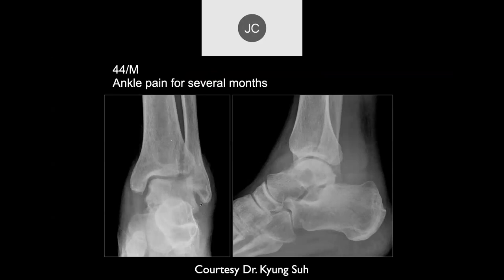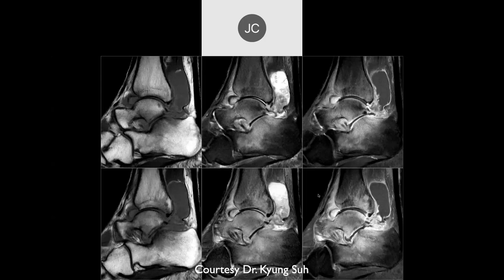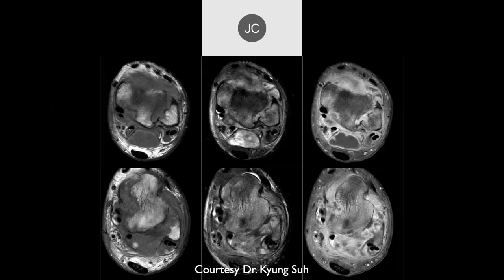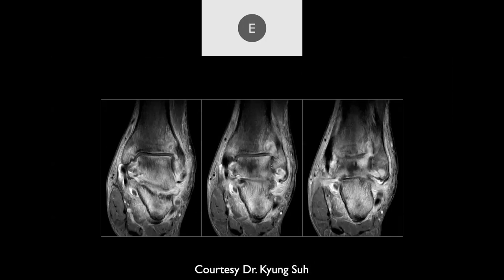A 44-year-old with ankle pain for several months. The subtalar joint region looks a bit sclerotic with the talus and calcaneus, and there's not much fat posteriorly. On MRI with contrast, there's a fluid collection extending posteriorly from the joint space, bone edema, and peripheral enhancement suggesting a big abscess. On PD fat-suppressed images, there's bone edema, probable subchondral disease, and fluid in the tendon sheaths — all likely infected. This was also tuberculosis arthritis.